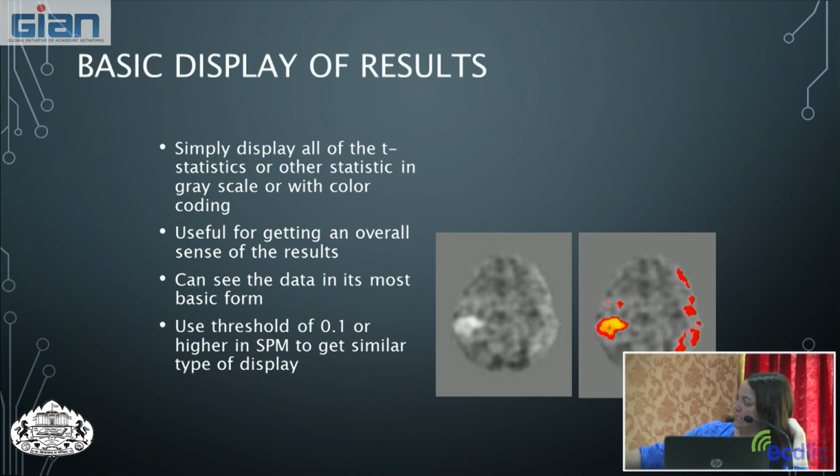In this case, the areas of yellow would be the highest activation. You can see on the left there that they appear whiter in our intensity image. So in order to make these stand out on the background of the brain, again, we might assign color values to them and then include a color scale map in our results, which is not done here.